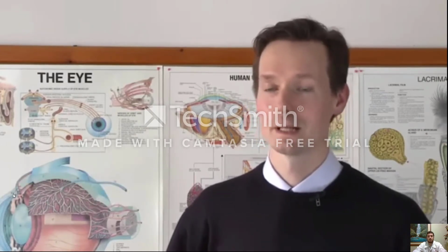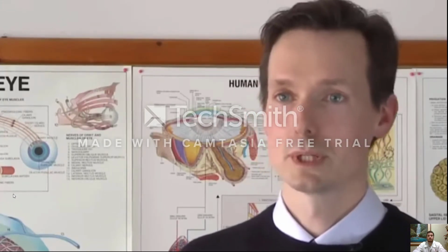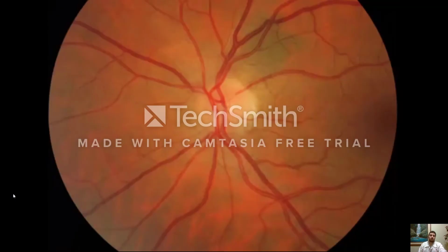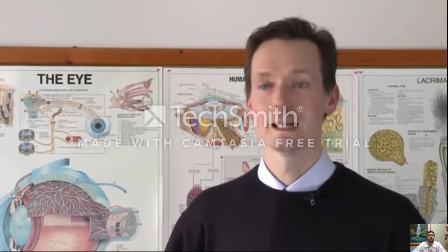Papilledema is swelling of the optic nerves secondary to raised intracranial pressure. Therefore, in any patient who has worrisome headaches, it's important to examine the ocular fundus looking for papilledema. Depending on the duration of the pathology which has caused the raised intracranial pressure, papilledema can go through various stages. The earliest stage can be quite subtle and difficult to pick up. It involves subtle swelling of the optic disc margins, mostly where the nerve fibre layer is thickest. So to start with, this is superiorly and inferiorly, and then later nasally.